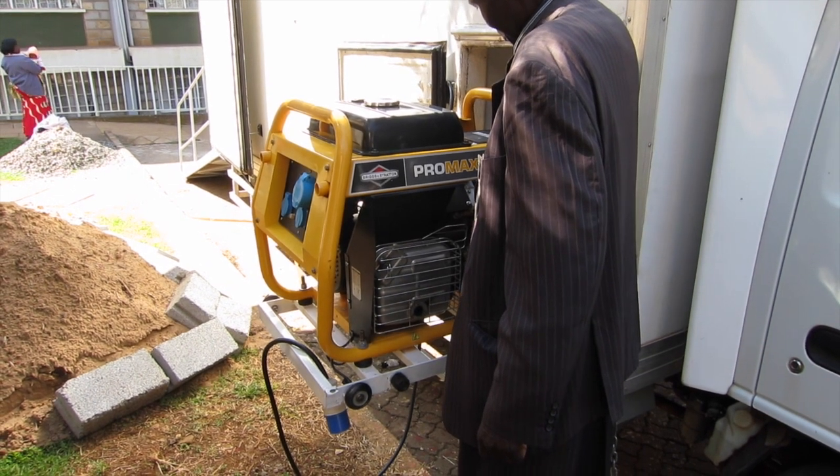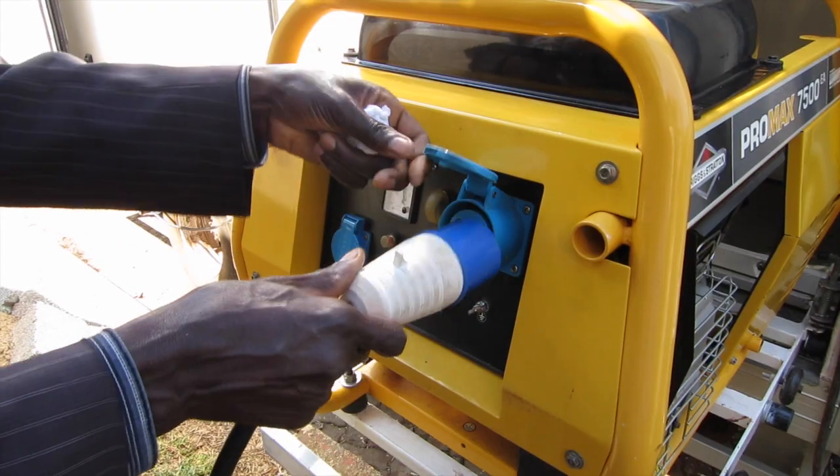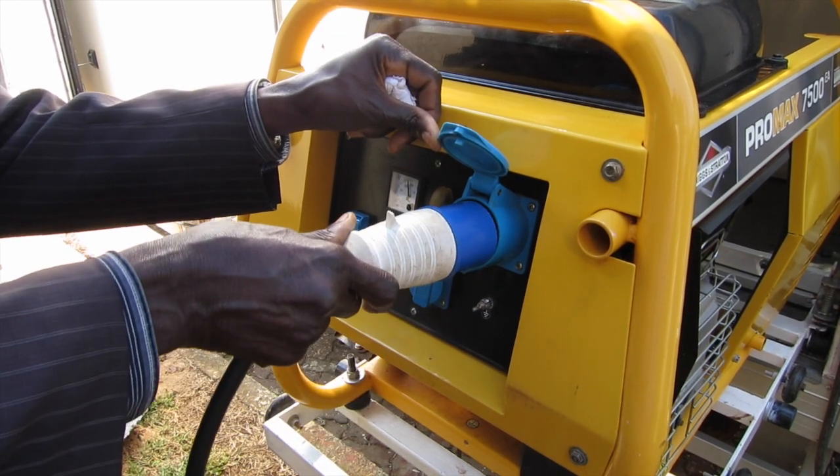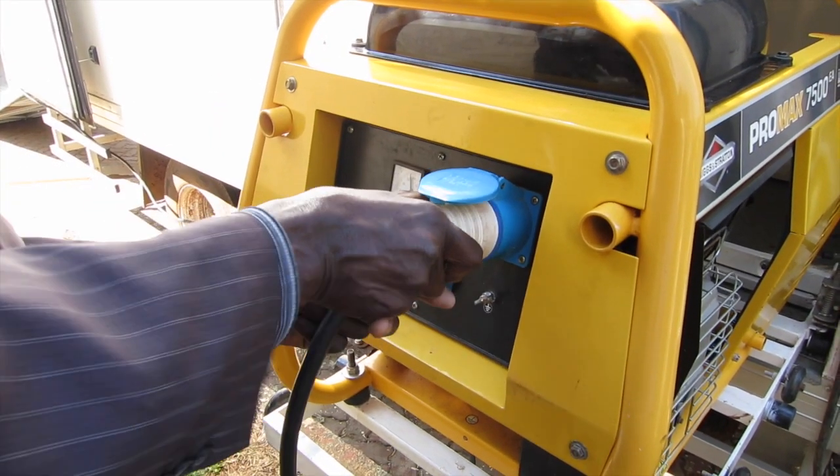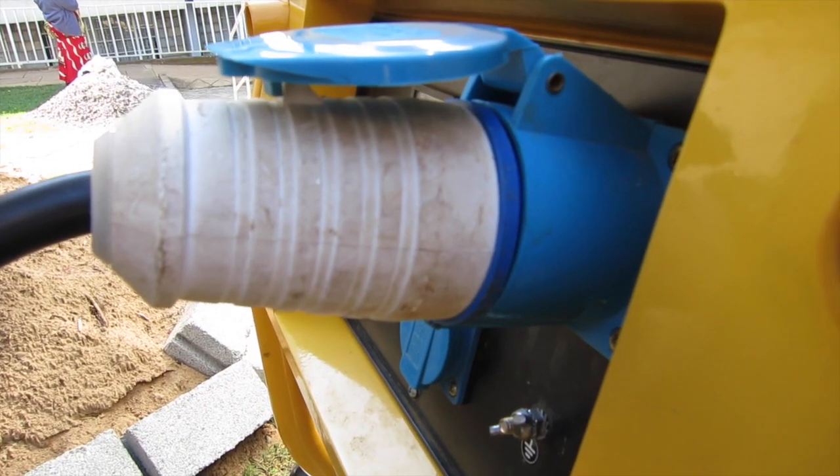Next, you can start the generator and insert the electrical connection. Make sure the electrical connection is flush.